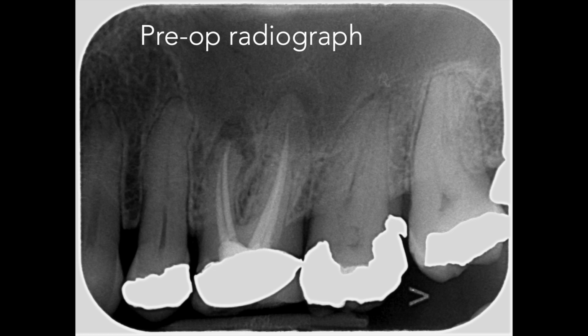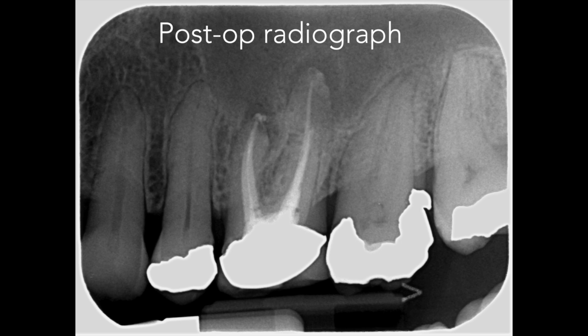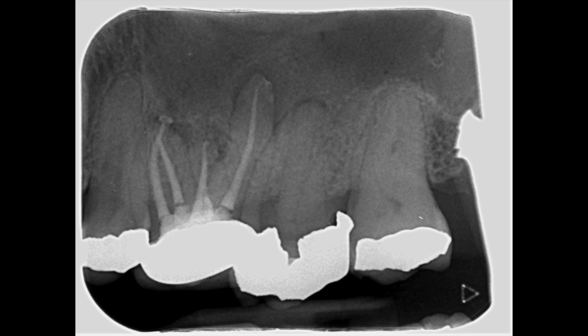Just a reminder of the preoperative radiograph showing the existing root filling, and a conventional view of the postoperative result showing a good coronal apical seal in all the root canals. There's an interesting delta at the tip of the palatal root, and you remember that this looked to be a little bit short in the preoperative. A distal angled view shows the confluence between all the root canals and the buccal canals very nicely, and again that delta at the apex of the palatal root.